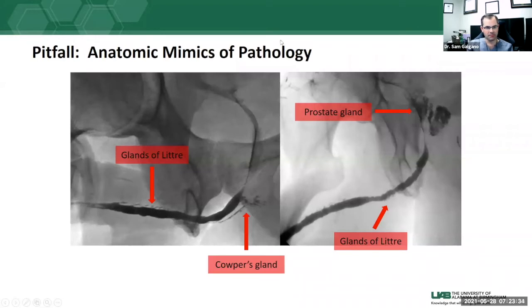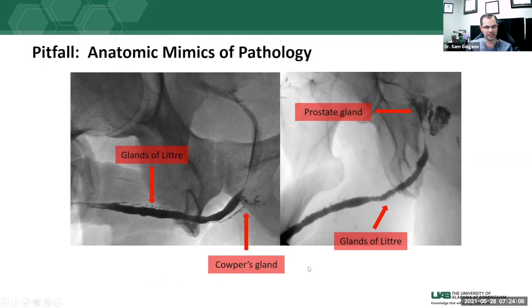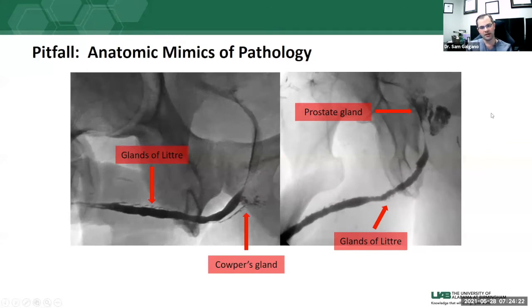Some anatomic mimics of pathology in the urethra include the glands of Littré, which can appear as small pseudodiverticula off the urethra on retrograde urethrogram — important to recognize so we don't call them a urethral leak. Retrograde filling of Cowper's glands can also occur. As you do more urethral imaging, you'll learn to differentiate these from actual leaks. One image shows prominent glands of Littré with filling of some prostate gland tissue, which can look unusual especially after transurethral prostate resections. Knowing the anatomy and surgical history is most important.